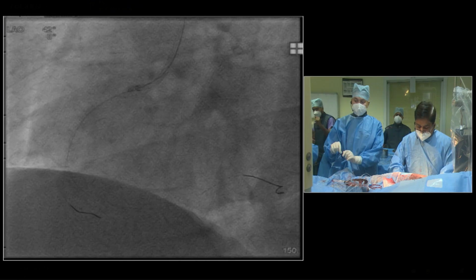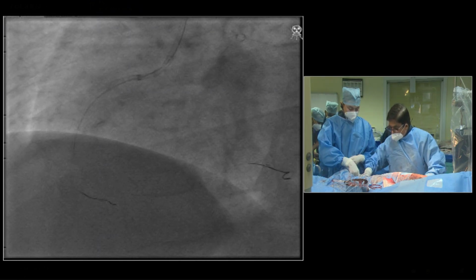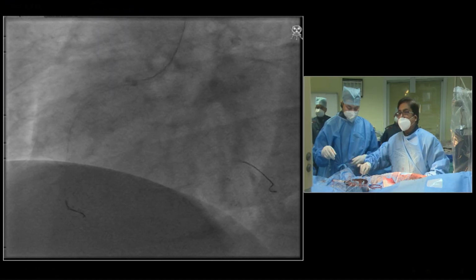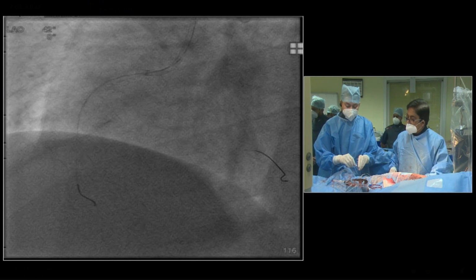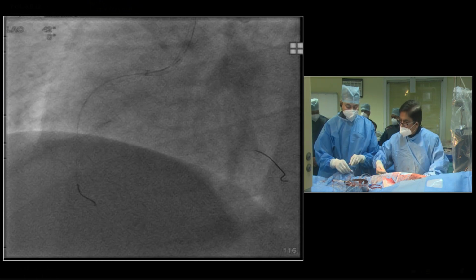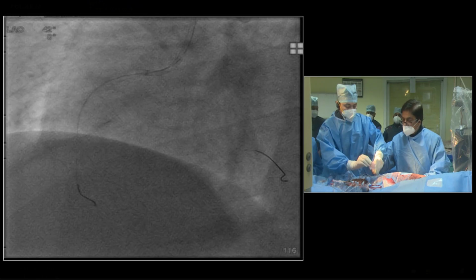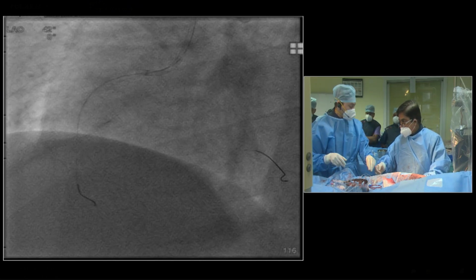So now I have the 2 wires. Now I have to identify. This one is more out, the longer wire. The shorter wire would be there. This is more out, so this is the PDA. The more out wire is the first wire. PDA side branch, put it with the gauze piece. Side branch, gauze piece. Main branch, not wet, dry. Wet takes a weight and it will fall.